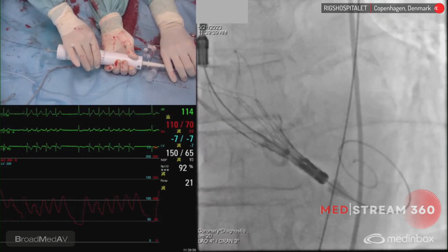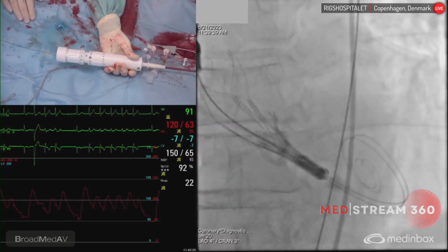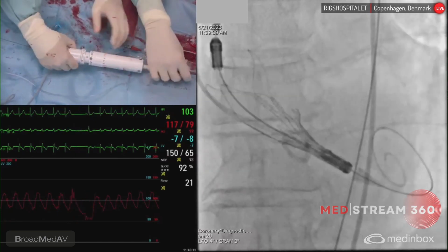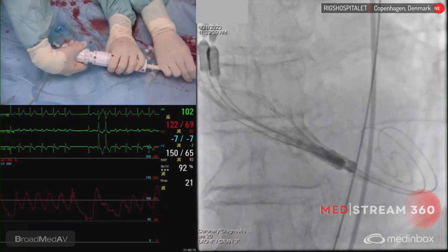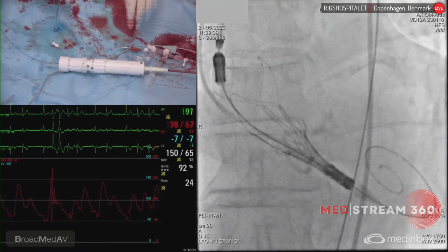You slowly continue. I built up already a little bit of extra push, 5 millimeters with the catheter. Yeah, it's good. All right, let's pace, maybe 140. Can we do that? Pin out, please. Give me the chance to push still. I'm definitely going to push. Yeah, push 5 more millimeters. I'm quite a lot on the outer curve. Well, don't lose time with that.